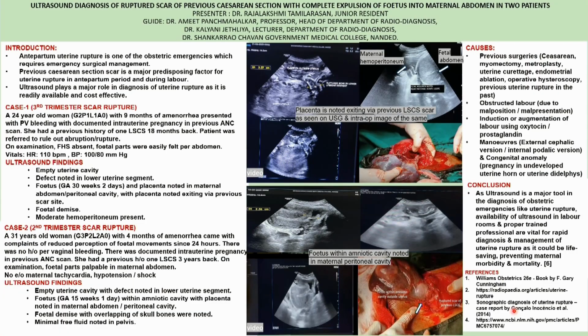Achha. So what is your experience till now? What are the scar sizes, and what methodology do you use while you're doing the scan? Do you do it transvaginally or transabdominally? Transabdominal, sir. Achha. So I'll tell you, because we've done a lot of work on this. Actually, some 5 years back, there was a thought that this is rubbish, don't look at scars. But I have a different experience of 20 years. We measured scars in almost all patients of previous Caesarean.